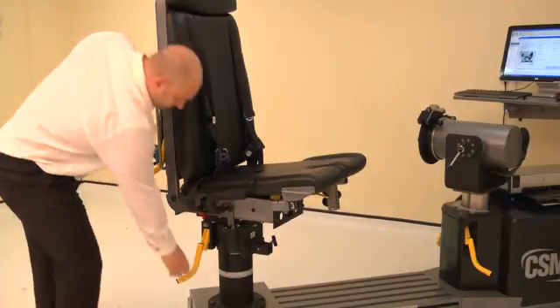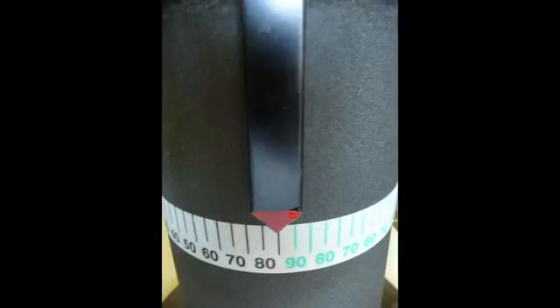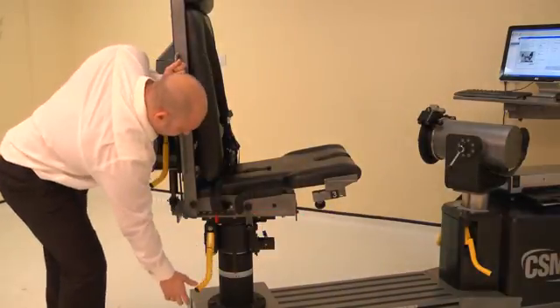Now adjust the chair rotation. Lift a locking handle and rotate the chair. For the left side, rotate the chair to 85 degrees on the black scale. Ensure both locking handles are pushed down to secure.